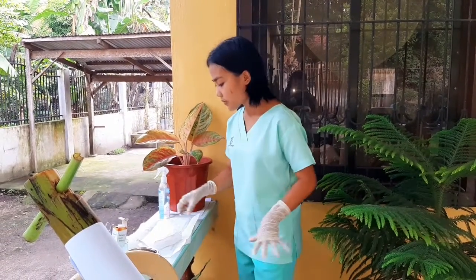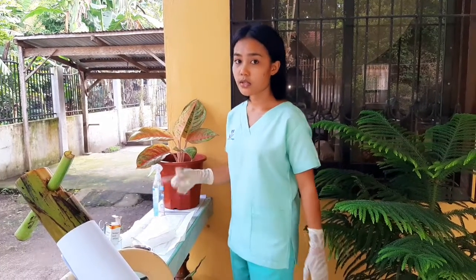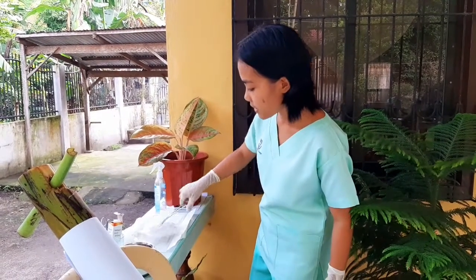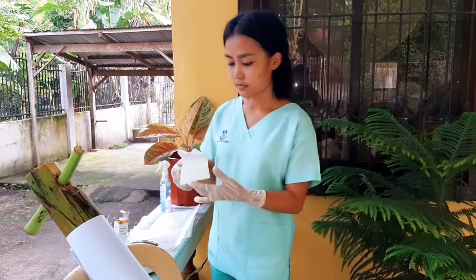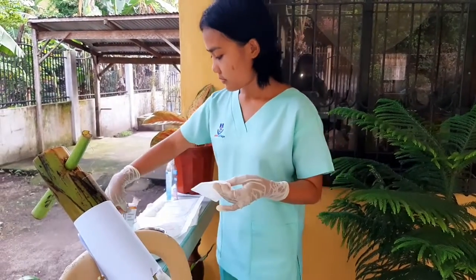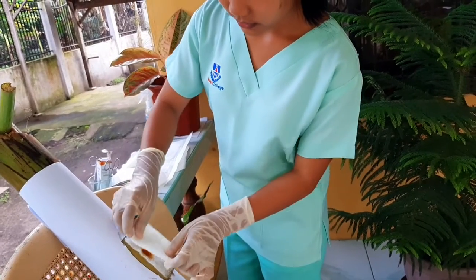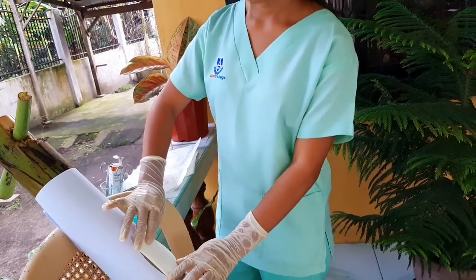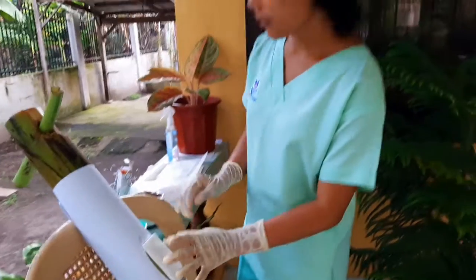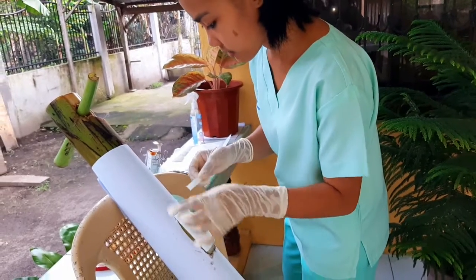The outside of the peel of the gauze is non-sterile, so I will be using forceps. Then I'm going to get a plaster so I can paste it secure.